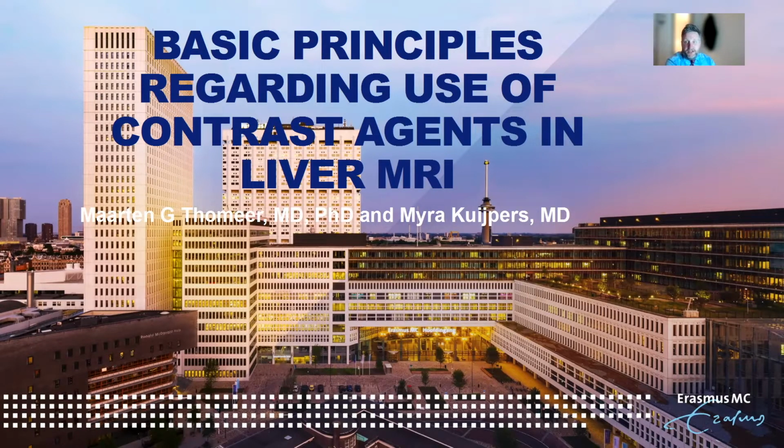At the end of December, I gave an initial webinar on the basic principles of how to evaluate a liver MRI. Often it is a combination of different findings that will help you to make a definitive diagnosis. They can be, for instance, the presence of blood, fat, washout. In daily practice, we seldom need biopsy or pathological proof. Most therapies are based on our imaging diagnosis. And I think this is also the case in most tertiary liver centers.